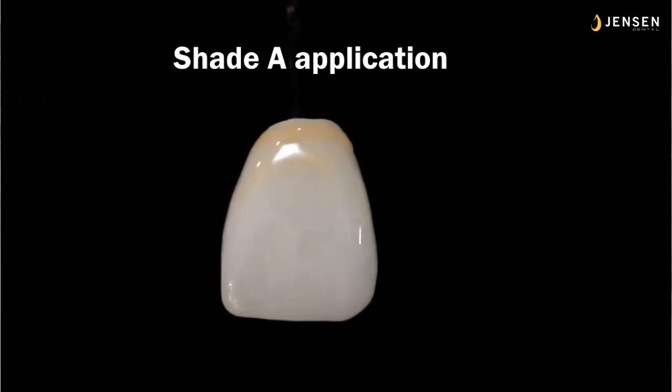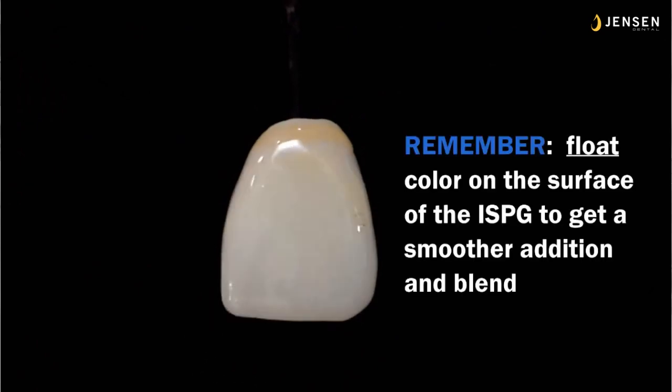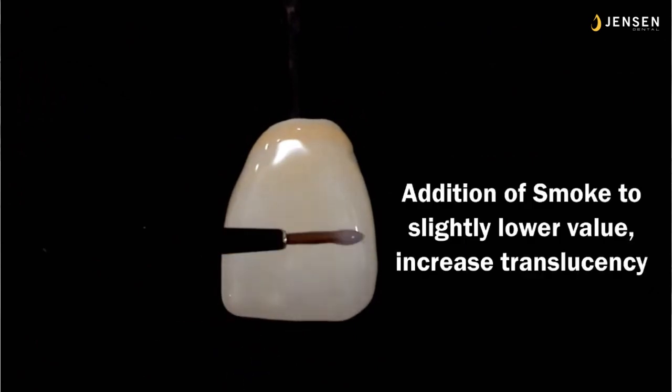And we have a little bit of shade A application here. Now, this is just a little bit speeded up here so you can see, because this wasn't really what I'm talking to. But remember to float color on the surface of the in-sync paste glaze to get a smoother blend. And in addition, it'll glide on a lot easier. If I'm trying to fill in or smooth it down, I'll use the smaller brush.